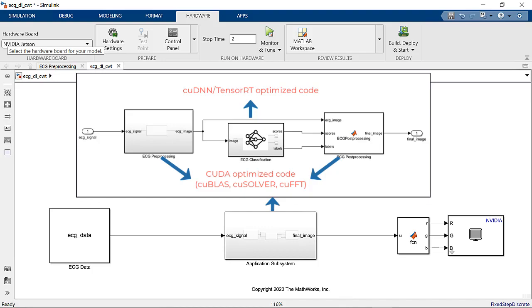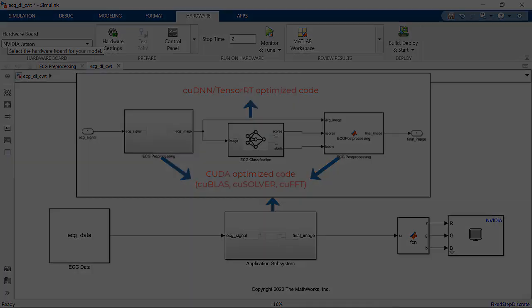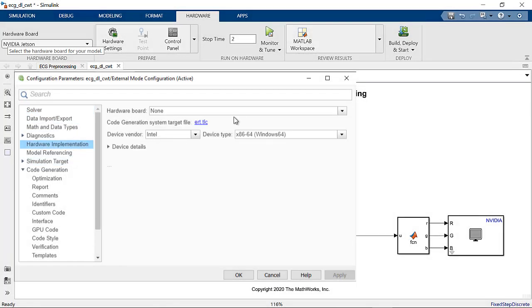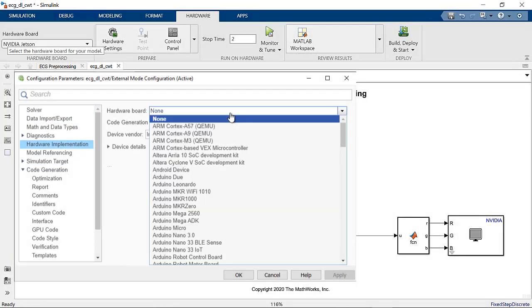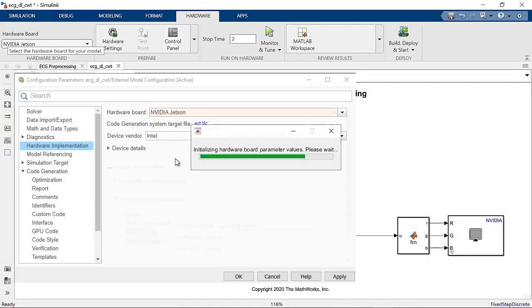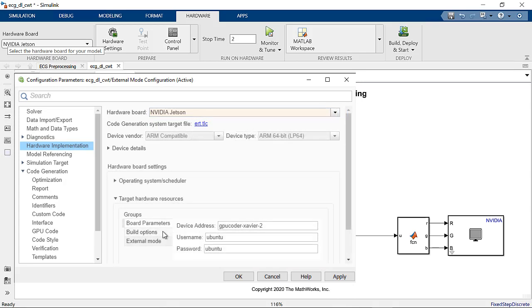Let's stick with the default settings for our example. With the hardware port set to NVIDIA Jetson and the build configuration set to build and run, let's go ahead and click on build, deploy and start button.